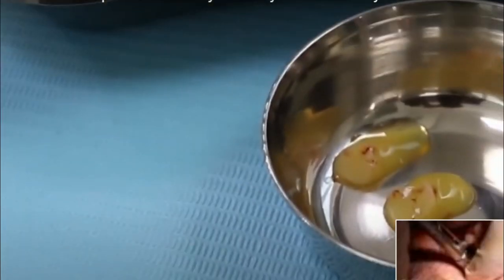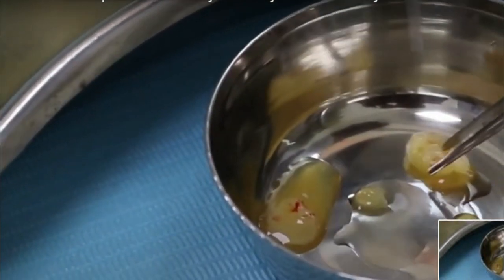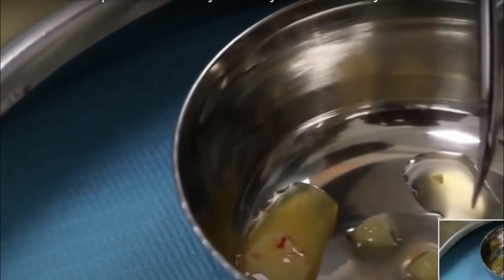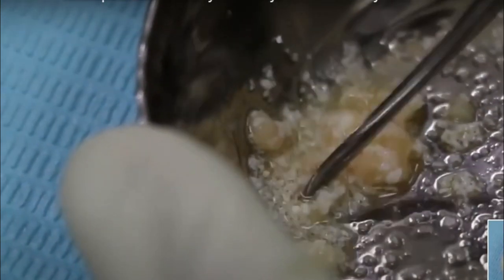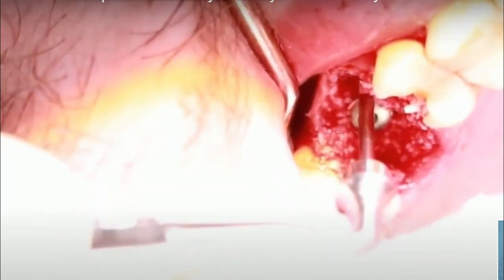We took PRF — we made PRF by taking the patient's blood, cut it horizontally into pieces, and made something called sticky bone using APRF and IPRF. What sticky bone does is it improves the handling characteristics of the bone graft. After the dental implant and the sinus lift procedure are over and done with, we can place this around the implant to create new buccal bone.